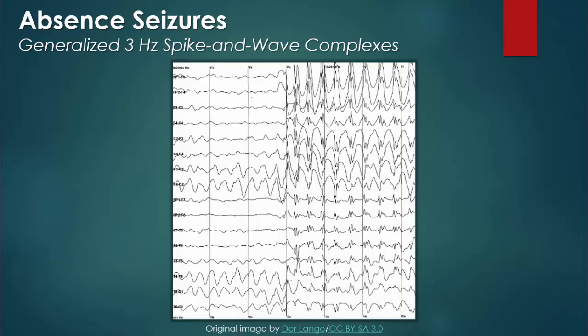This EEG was recorded while a patient was experiencing an absence seizure. The first characteristic finding that may come to your attention is the sudden change in activity that occurs about halfway through this reading. While the first half is normal, with a posterior dominant rhythm, the second half begins with an abrupt onset of epileptic discharges.